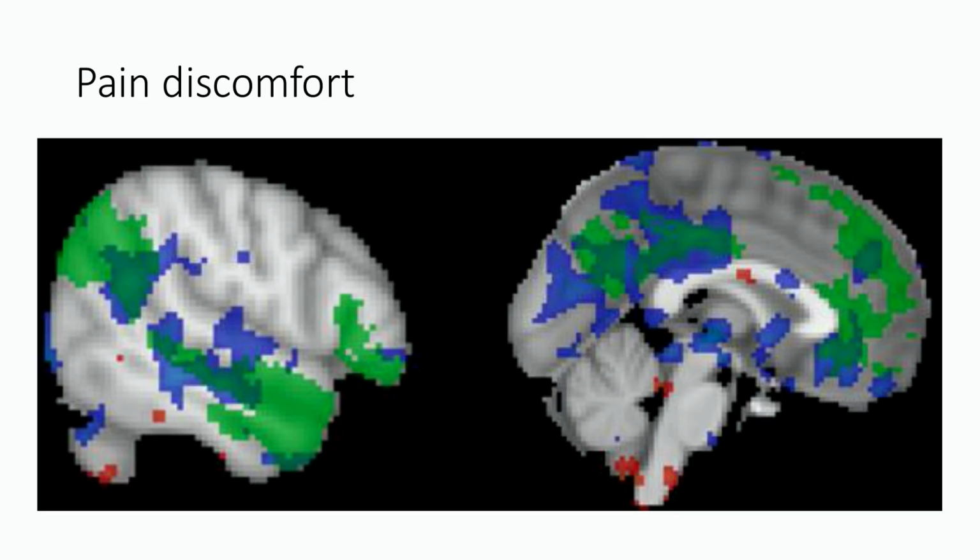Another issue is TMS feels like something. For those of you who have had TMS, having a flick on your scalp, flick, right? That's a really good way of activating your brain stem, your dorsal cingulate, your insula. They're kind of common regions depending on how painful the things are. The DMN will turn off nicely just to a flick on the head that doesn't actually engage the brain. So one of the strategies we have is to ask participants, how bad did that one sting or hurt or discomfort, and regress that out of the image.